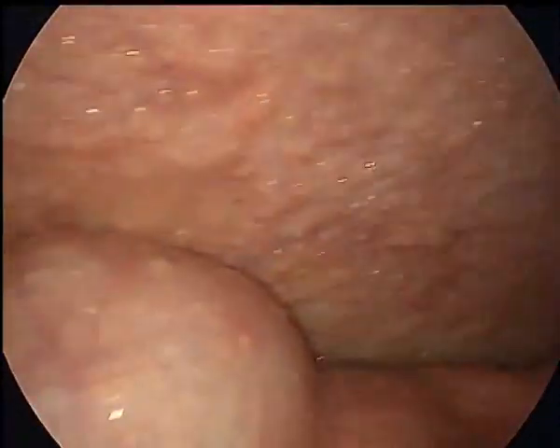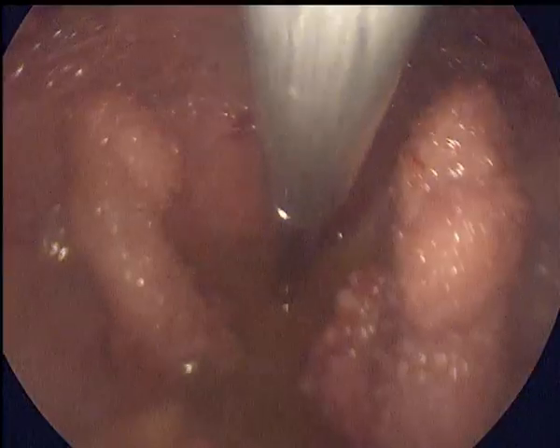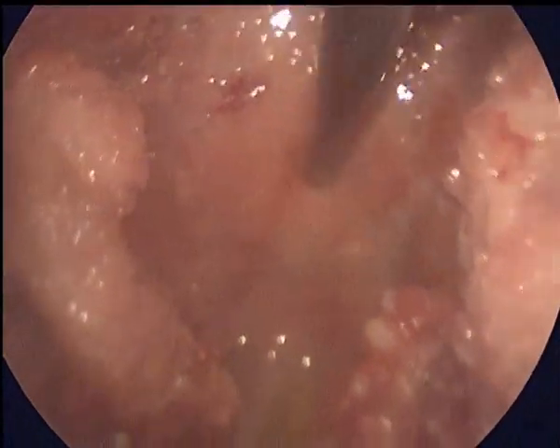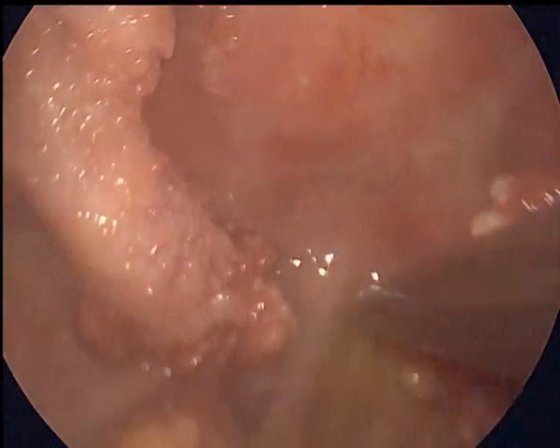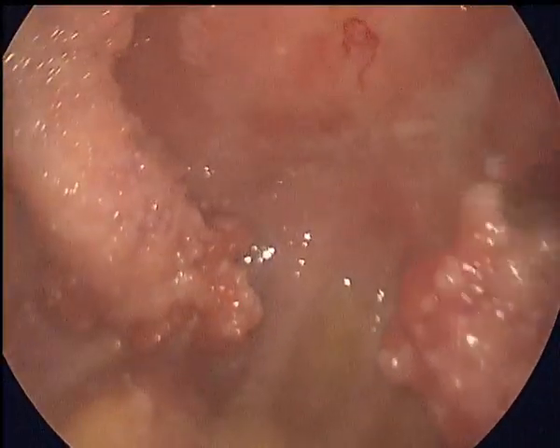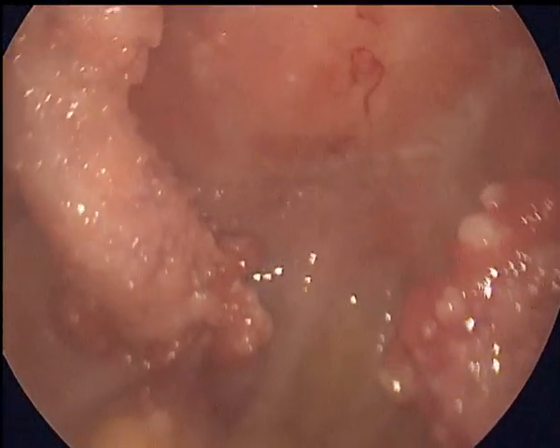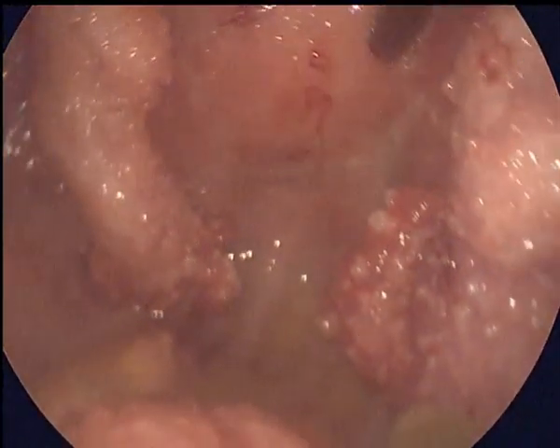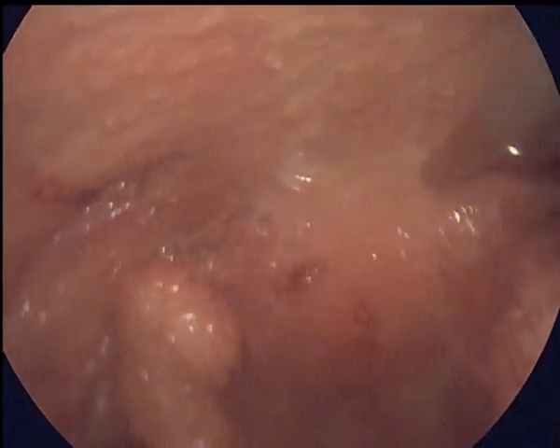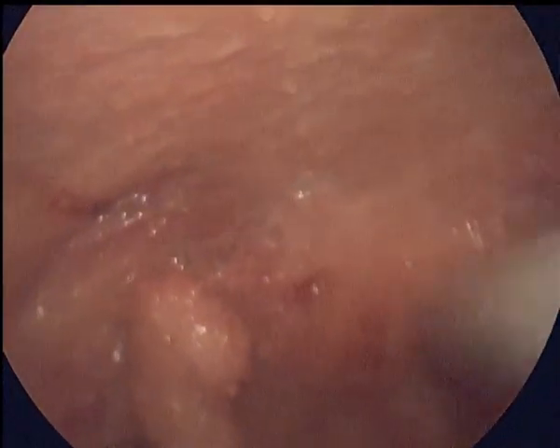Then we look into the pelvis, and when we look into the pelvis we found the uterus is ventrofixed, both the tubes are studded, but there is no deposit on the POD. This is our rectum. Here the ends of the tube are studded with multiple deposits. Here the uterus is ventrofixed. Here you can clearly identify that.